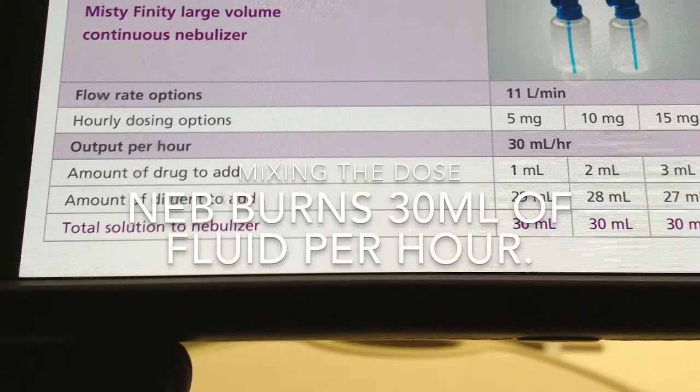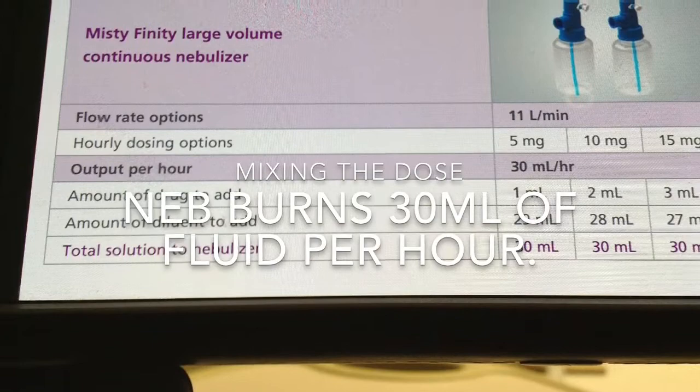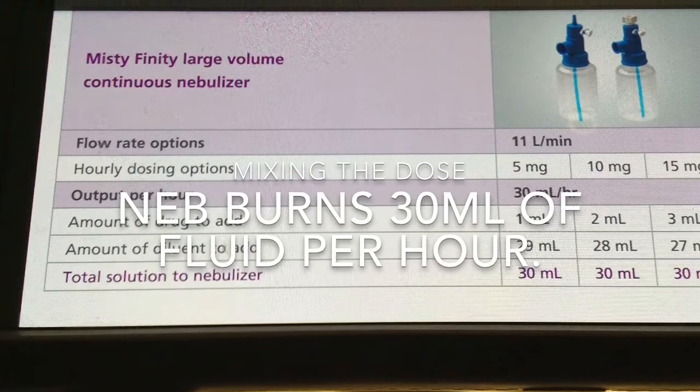In this video we're going to demonstrate how to give a continuous nebulizer to a pediatric patient in the PICU. The physician is going to order how many milligrams per hour he wants to give the child and also how many hours he wants to give it.